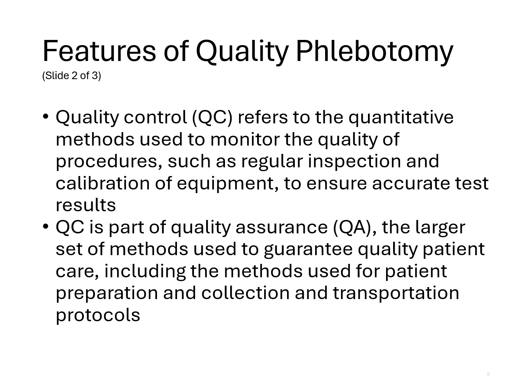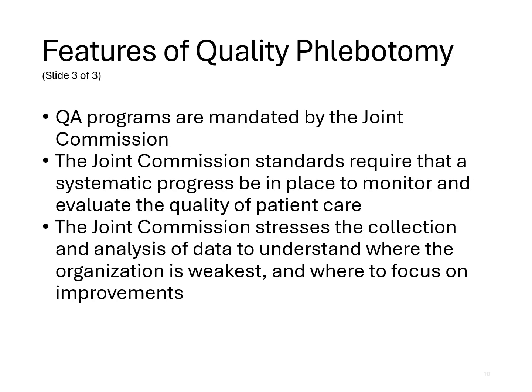Quality control, or QC, refers to the quantitative methods that are used to help monitor the quality of procedures. We do this by regular inspection and calibration of the equipment that we use, and that helps to ensure accurate test results. QC is part of a larger program called Quality Assurance, or QA, the larger set of methods used to guarantee quality patient care, and this includes the methods used for patient preparation and collection and transportation protocols as well. QA programs are mandated by the Joint Commission.